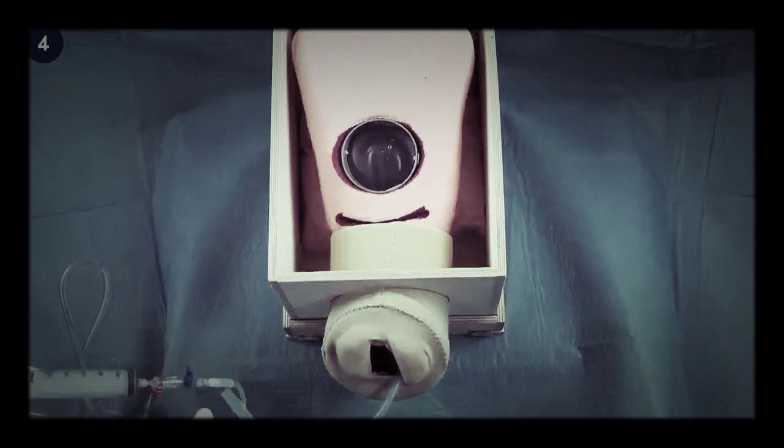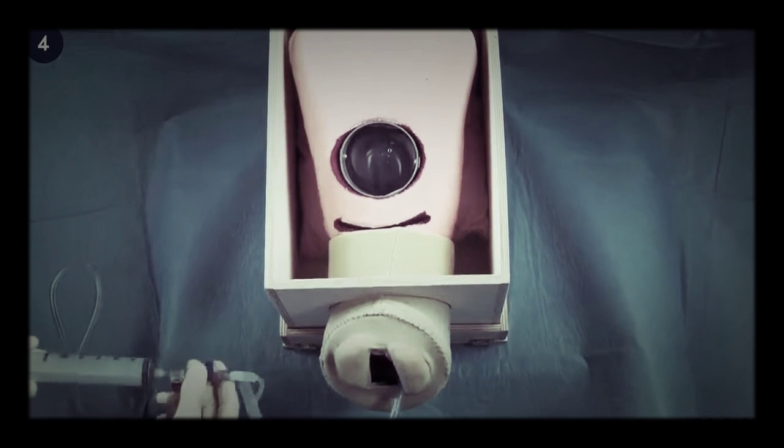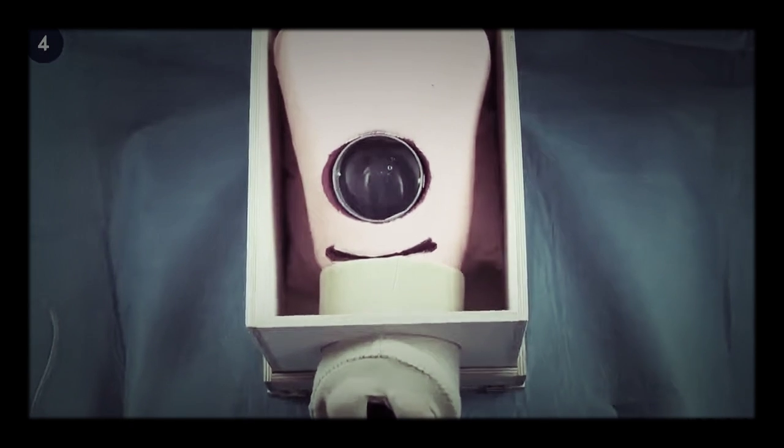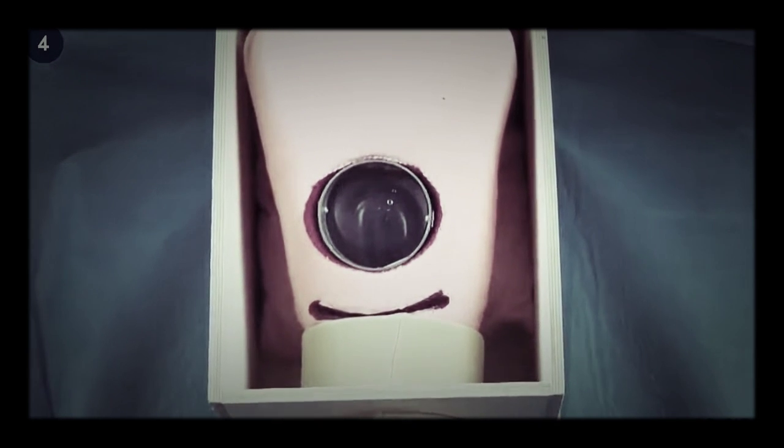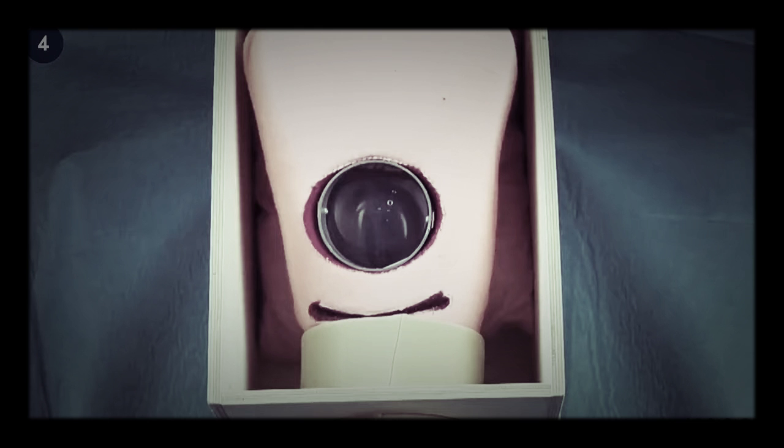Lastly, a fluid collection bag is used to monitor uterine bleeding. The balloon should remain inflated for 12 to 24 hours and it is advised to combine this with the administration of antibiotics.